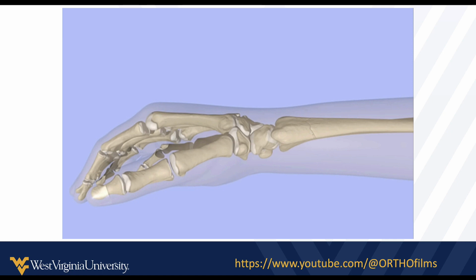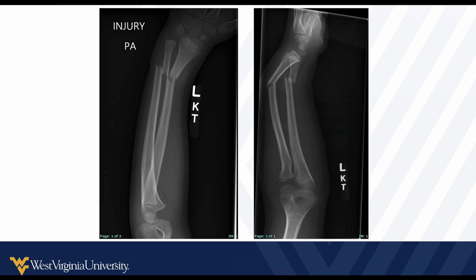Again, a distal radius. I go over that because these are common, and our case is a little bit different. In this case, this is more of a distal third both bone forearm fracture, and most of this can be resolved largely with traction, although you may require some recreation of injury and then some exaggerated corrective motion as well. So here, this is the pre-reduction images. This is what they look like, and that's what we did in this case. After sedation, one assistant helps with traction, and then manipulation with recreation of the injury, traction, and then some exaggerated corrective motion and to look at the alignment.